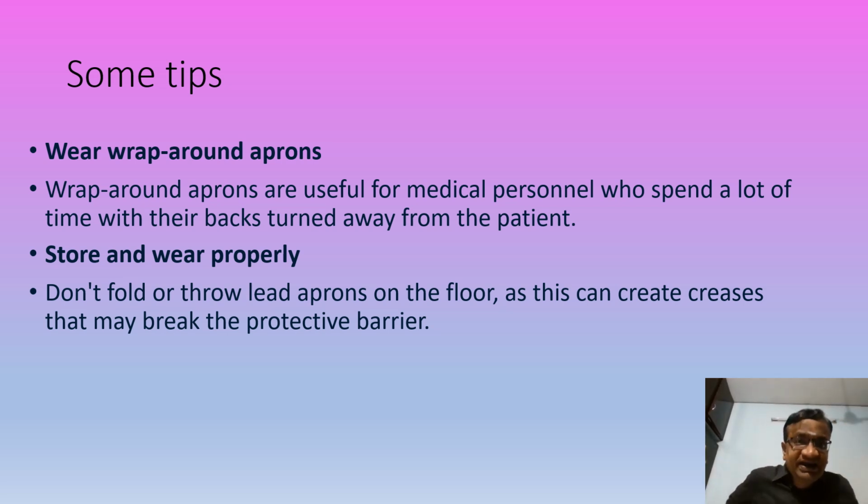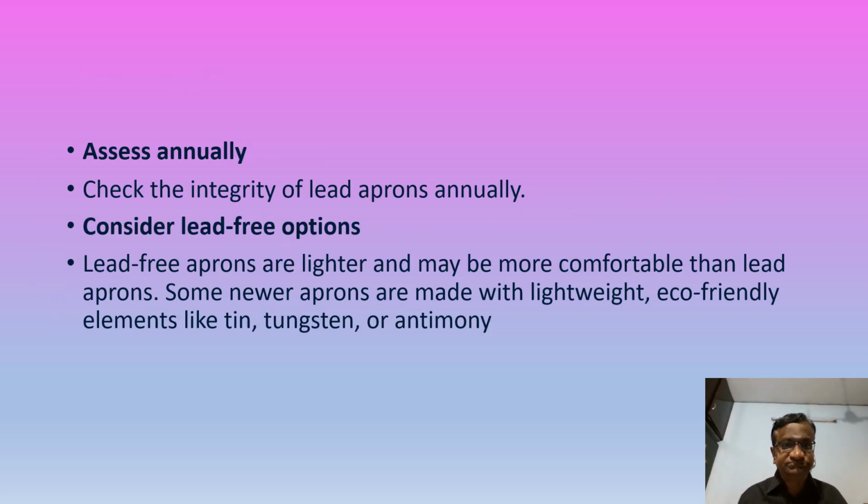Wear wrap-around aprons because you go this way, that way, you talk to a computer, you check it, and you go and take one ciprofloxacin ampule, all these things. So, wrap, store and wear properly. Assess annually. Consider lead-free options.